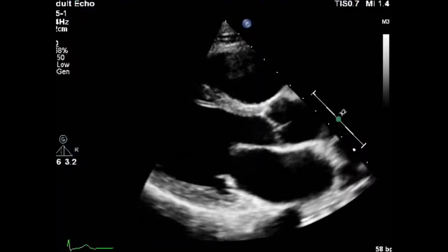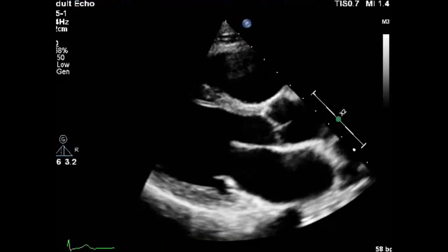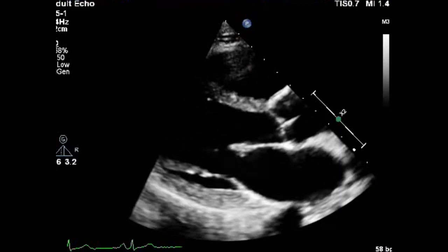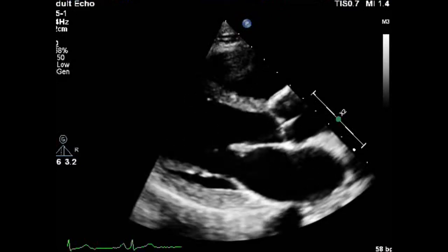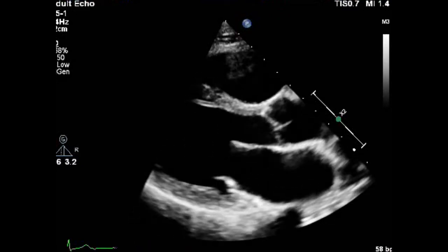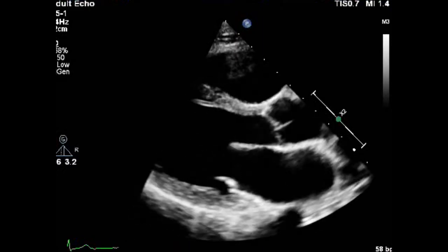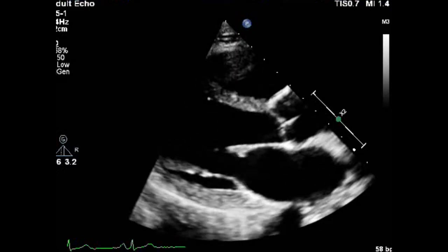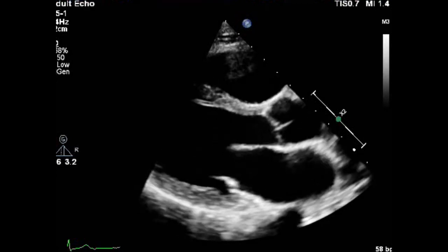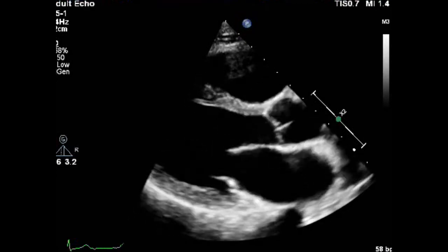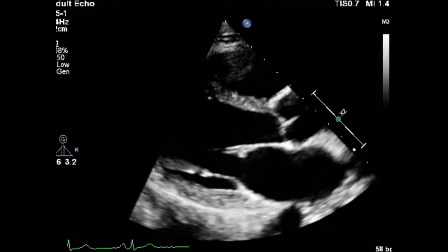The first thing you have to do is ensure a good ECG tracing. And always remember to do a global qualitative and quantitative evaluation of the chamber size. This is the parasternal long axis view, and in this view we can measure the left atrium diameter.